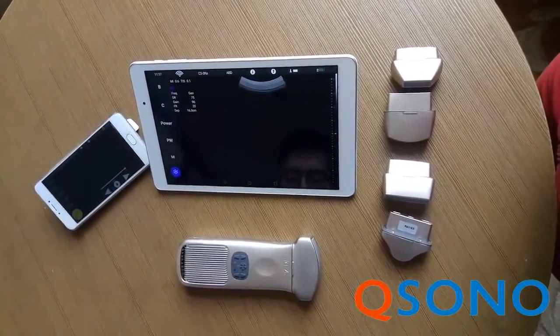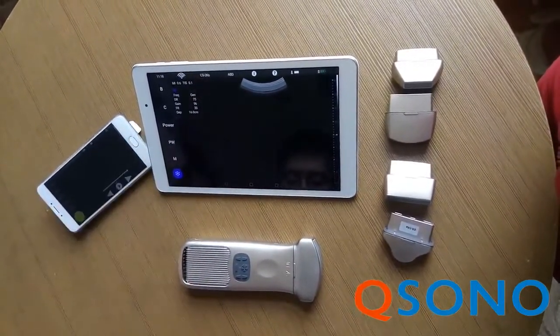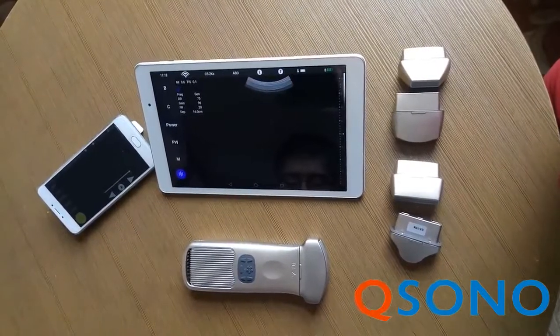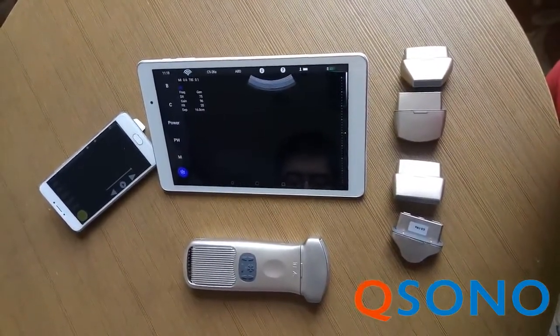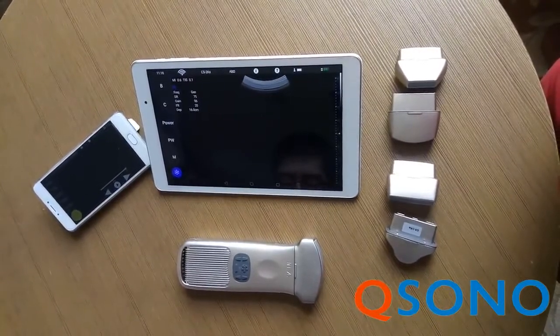And the secure and stable wireless connection: it uses Wi-Fi to connect to its app on Android or iOS devices or Windows. It does not require internet access to operate.